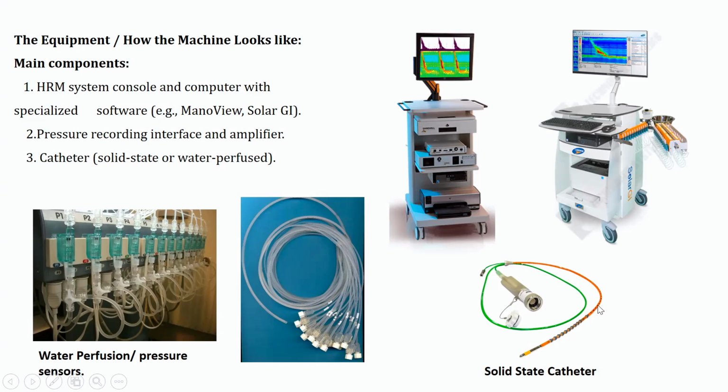Most of the catheters have 36 channels, and for sure they are reusable. There is no single use solid state. So I believe that solid state is easier to use, but it's more expensive.